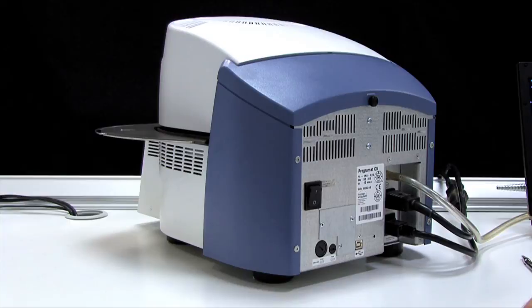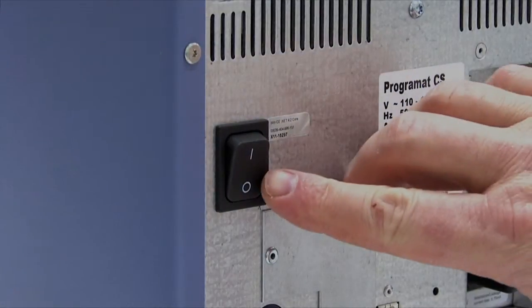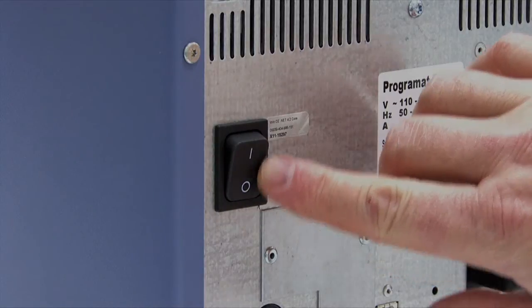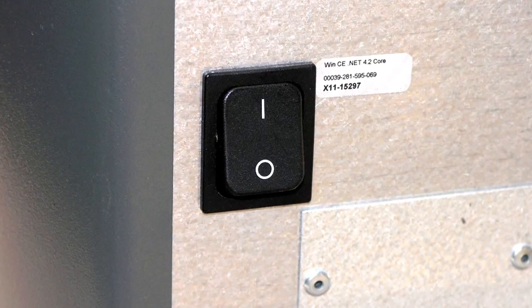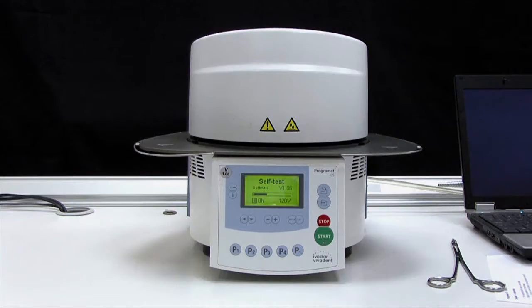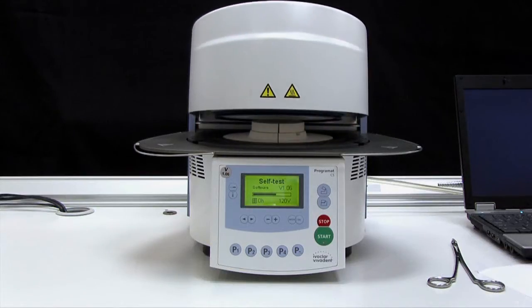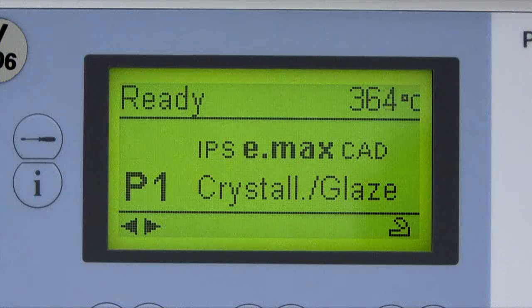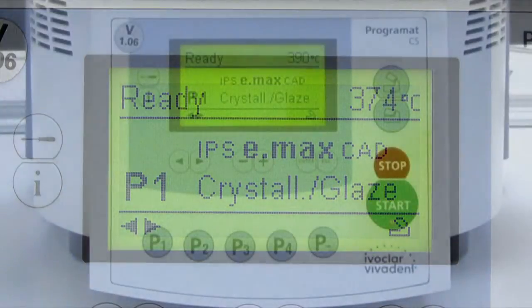The Programat CS power switch is located on the back of the furnace. To power on, place the switch in the I position. The CS will automatically go through a series of self-tests, which will last approximately 3 minutes. The word 'ready' will appear on the top left of the graphical display, indicating the CS is in standby mode and is set to the last program used.